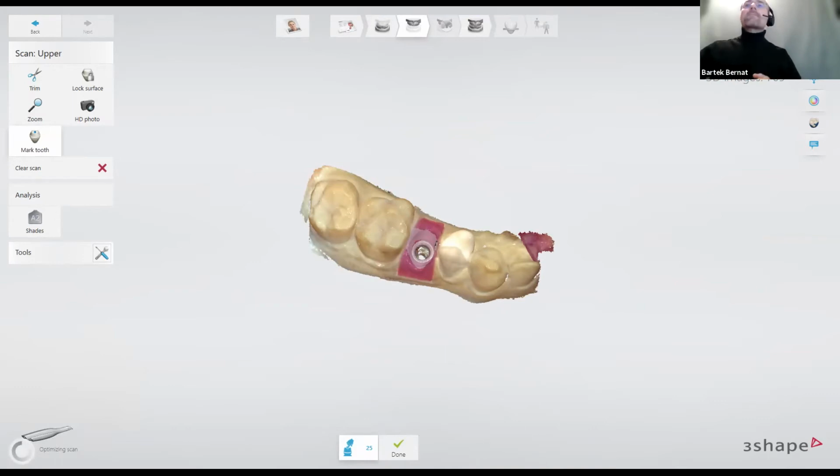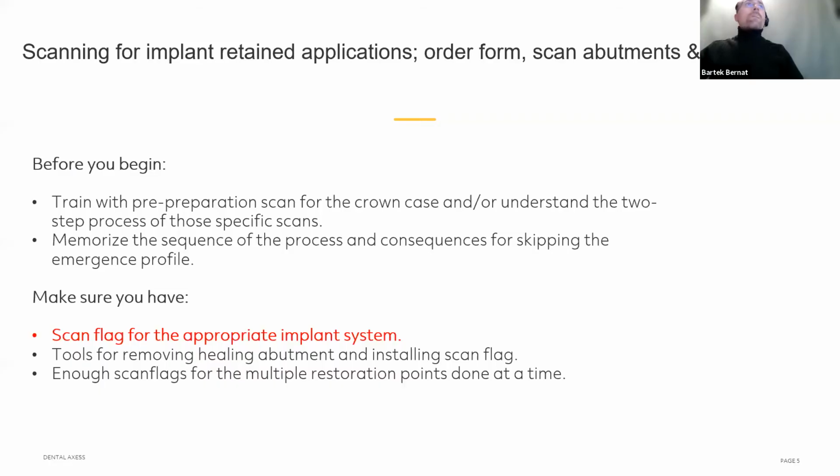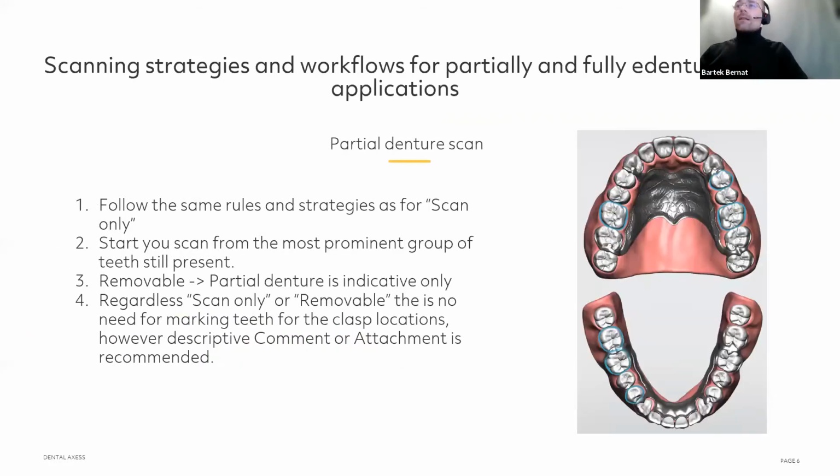Okay, let's just switch to the next topic. Good. So now the next topic is dentures. So we're going to start from the partial denture.